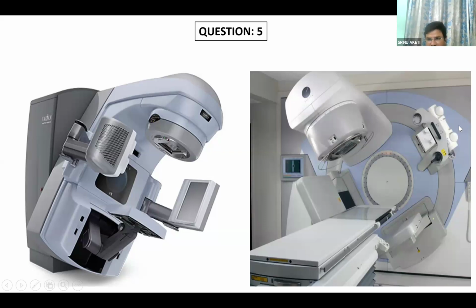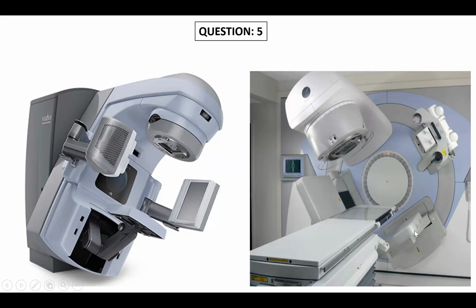Actually, the cover was removed here. There is a cover actually, and these are the X-ray tubes. This is for CBCT, 3D verification, KV imaging, and this is the corresponding panel, and this is the EPID panel. You can see my cursor, no? Yes, sir. This is the EPID panel. This is the collimator. This is the gantry.